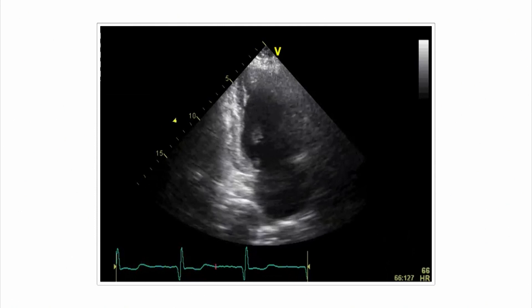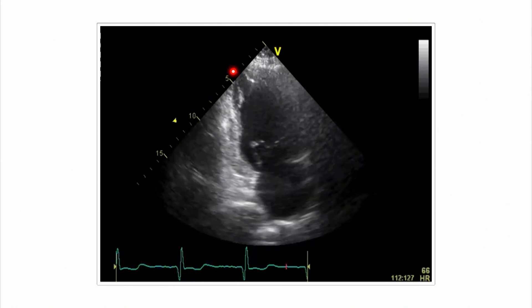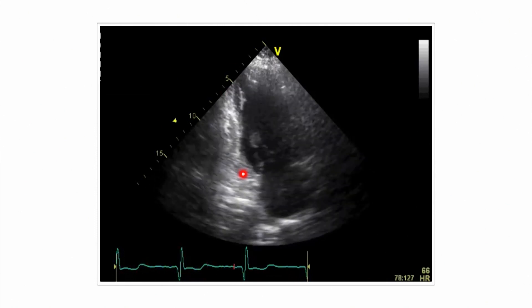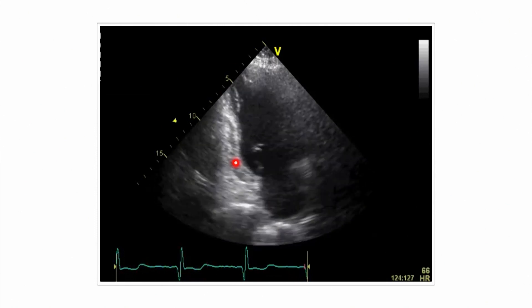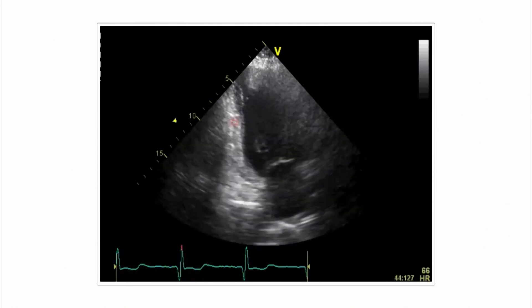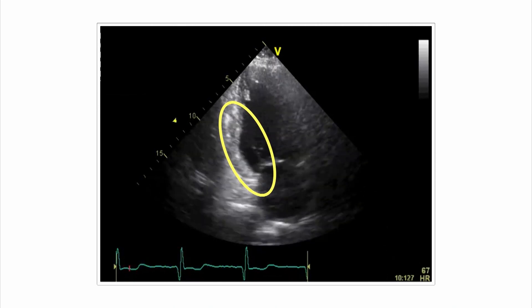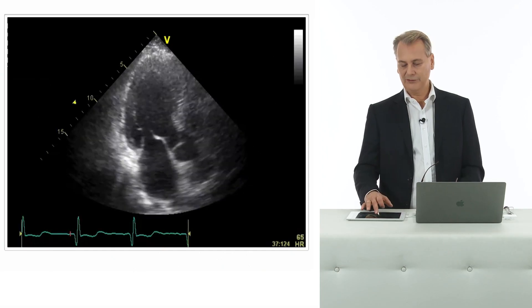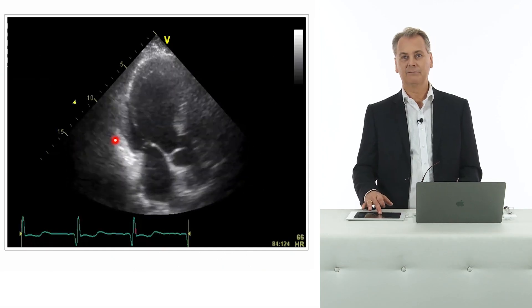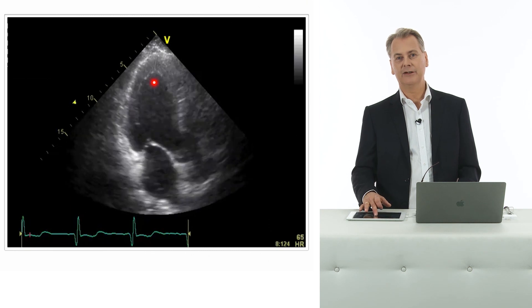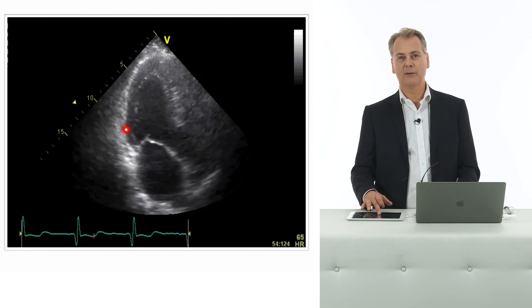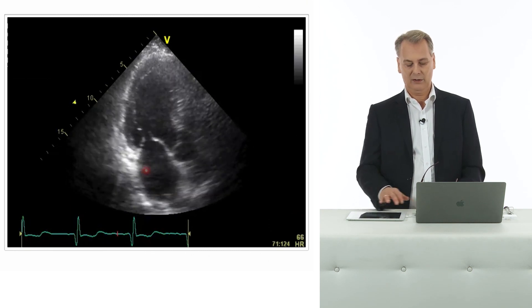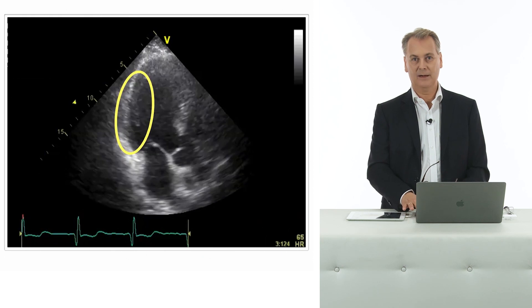Here is the two-chamber view with the inferior wall. You can see that there are wall-motion abnormalities in the basal and mid part of the inferior wall. We also see that there is hypokinesia or a problem in the posterolateral wall as well.